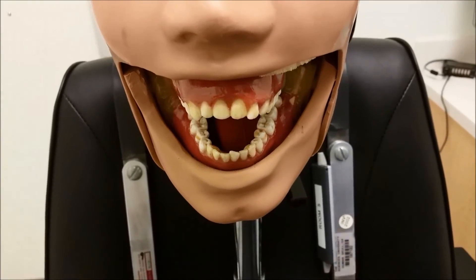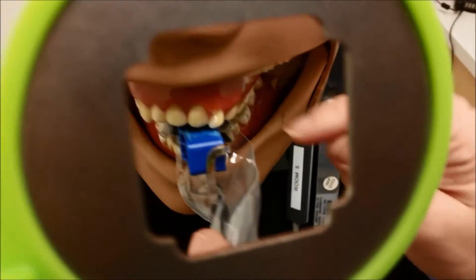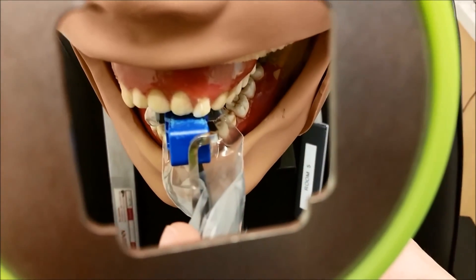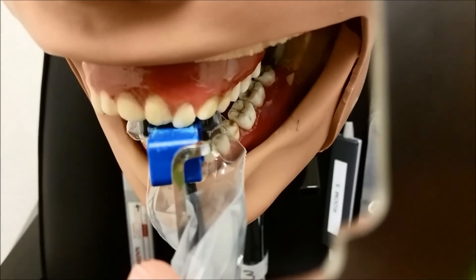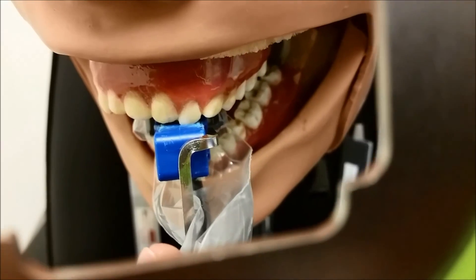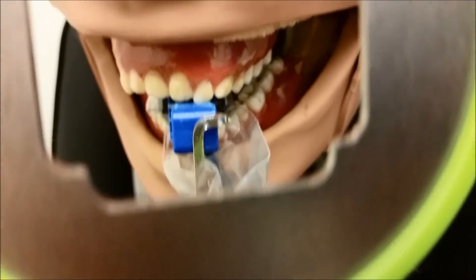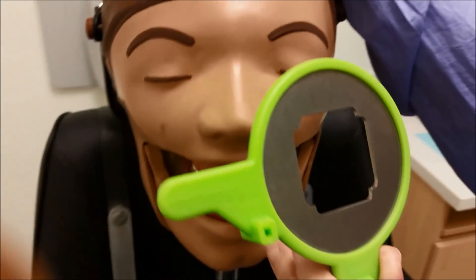Now we're going to go ahead and do our central lateral, going in at a steeper angle. Line up the contact between the central and the lateral and make sure that it's in the middle of the bite block. Go ahead and bite down.